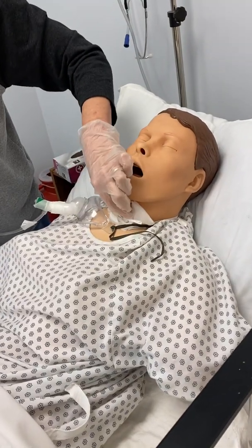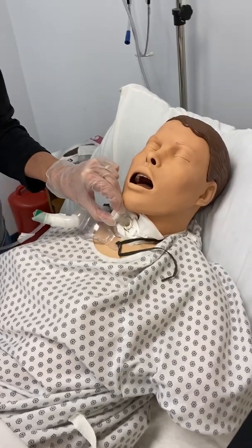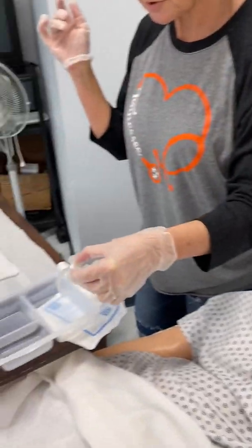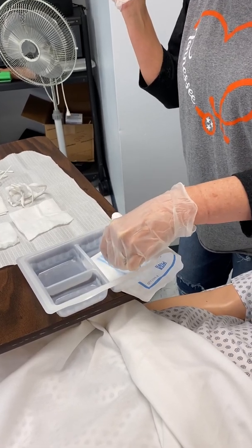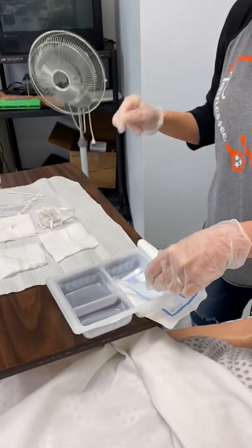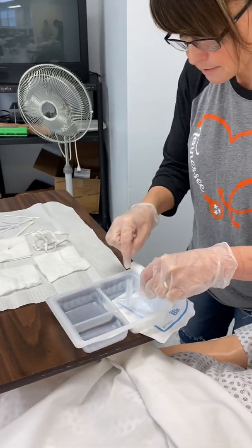I'm going to take out the inner cannula. And I want to be sure not to touch the inside of that cannula to anything. So I've got it. I'm going to put it in my first basin. All I can touch is the white part with my contaminated hand. With my sterile hand, I'm going to take my cleaning.